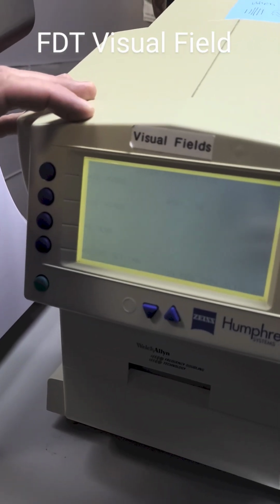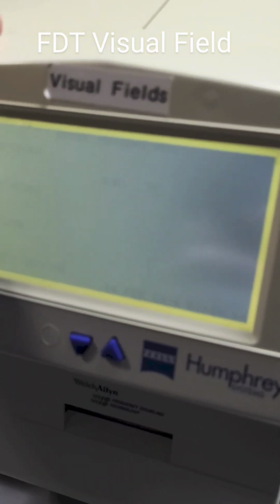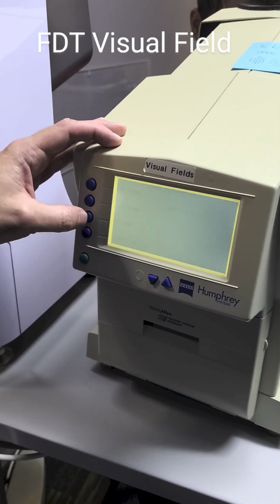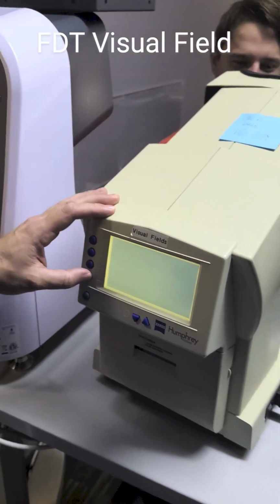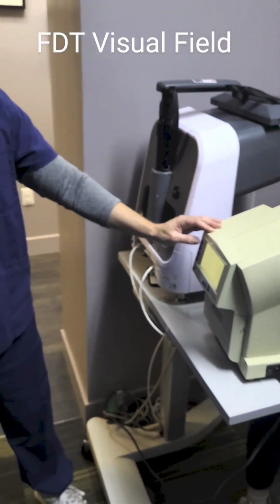And then enter the patient's age. In this case, the patient is 27 years old. So I'm subtracting 10, it starts with 50, and I'm adding ones until I get to 27. All right, hit accept. And then the test we use is screening C20-1.